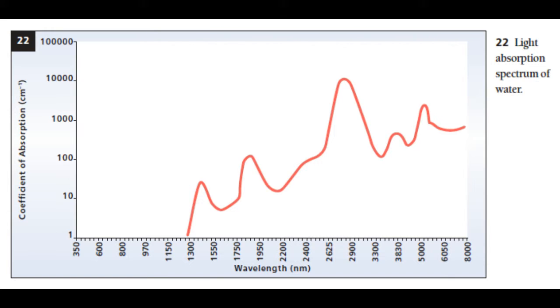Of note, light at 1320 nm is least absorbed by water and, consequently, has the greatest optical penetration depth in the skin, defined as the depth at which laser energy is attenuated through absorption and scattering to 1/e, or approximately 37%, of the original value. From the study of the 1450 nm wavelength, it appears that at least one mechanism of action of the mid-infrared lasers may be functional, if not structural, alteration of the sebaceous glands.